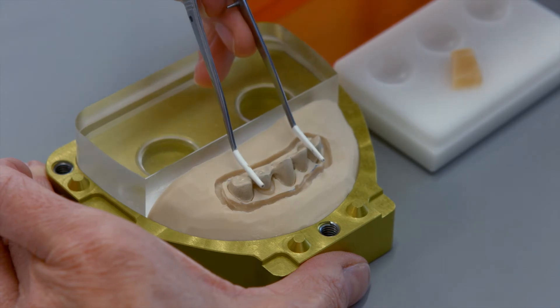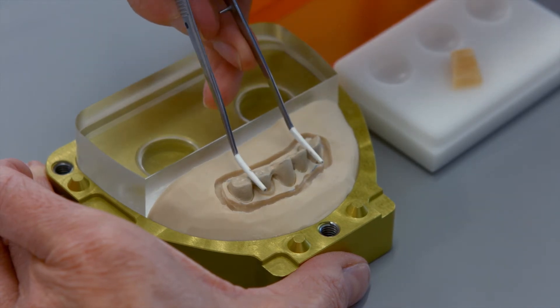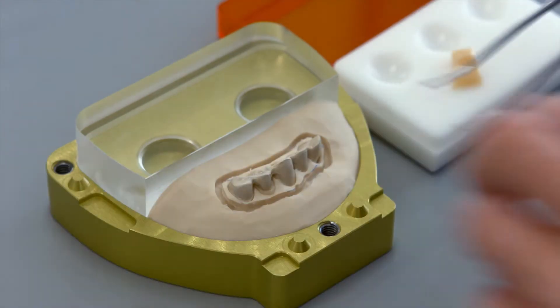Carefully place the framework on the silicone segment of the flask base and press it down lightly. Coated tweezers are suitable for this purpose.